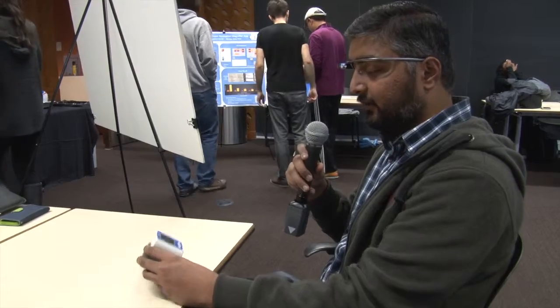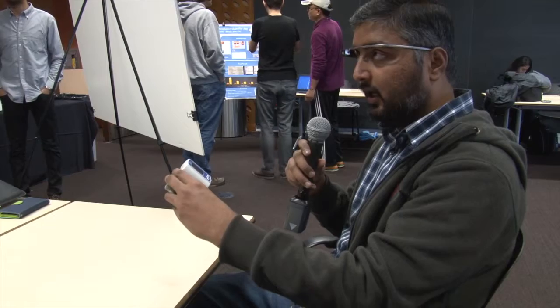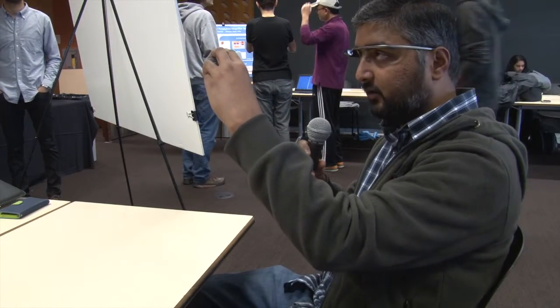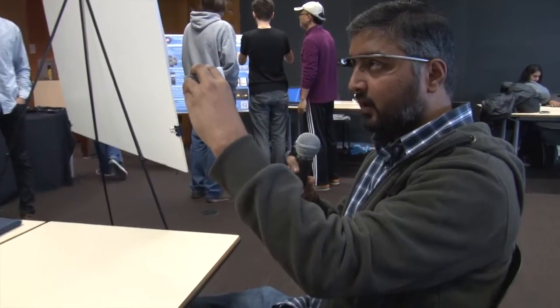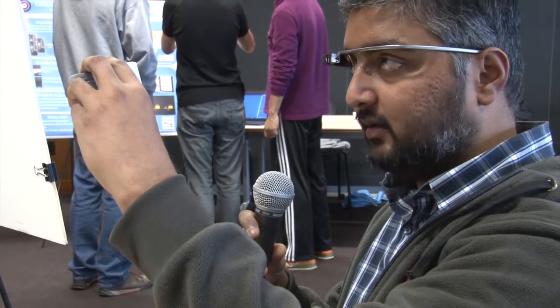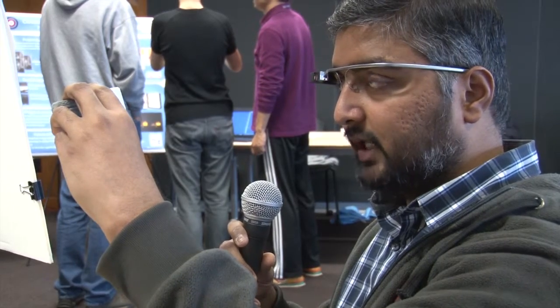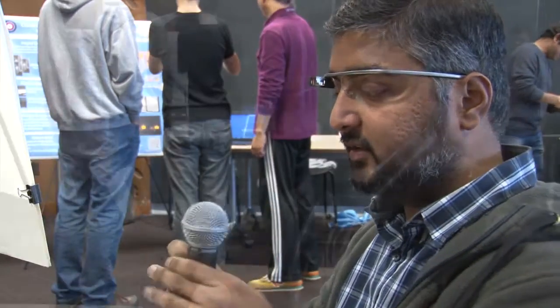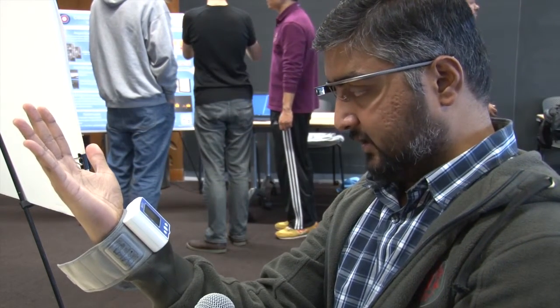So at the beginning of the app, we receive an audio instruction to hold the monitor upright in front of the Google Glass camera, in the center of the screen. So I'm holding it in the center, and it has now successfully recognized the device and also the orientation of the device. It is now giving me the next step, step 2 instruction, to put the monitor on my wrist. I'm now waiting for the computer vision code to recognize my hand and the device.